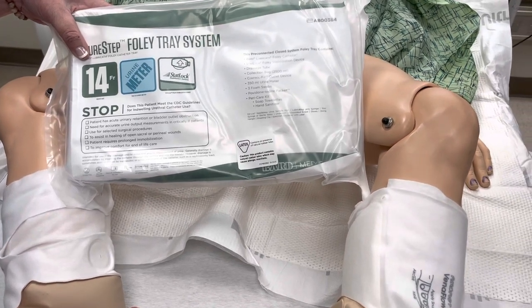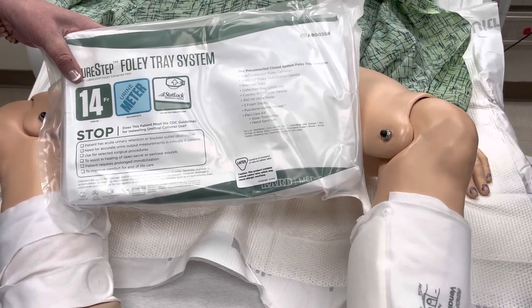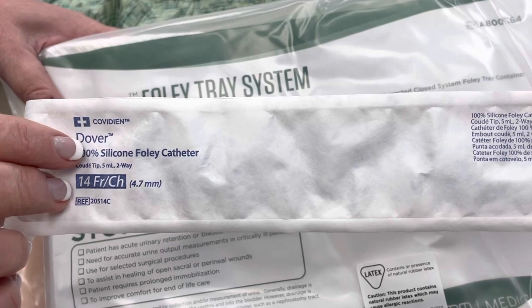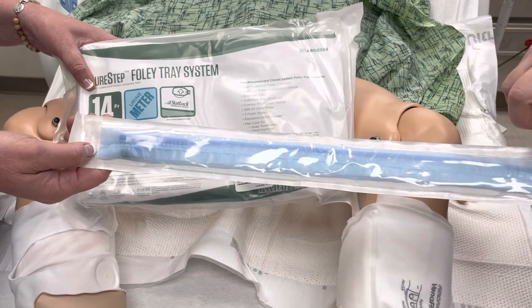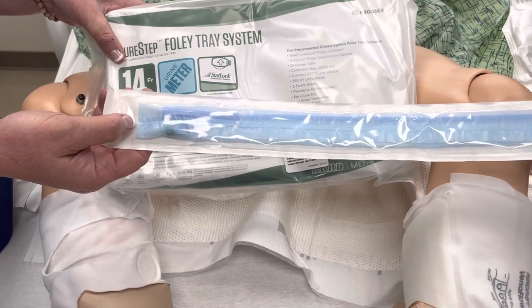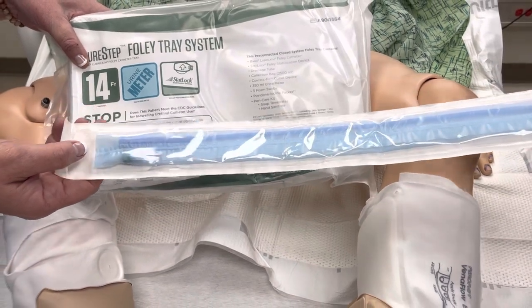Coude tip catheters look a lot like the catheter that's packaged in the system; however, the tip is curved to be able to go around the prostate more easily and to be more comfortable for your patient. Those are stocked in your clean supply room along with your catheter kit, so you would need to grab that in addition to your kit — it is not part of what's packaged in there. It is packaged in two layers: the first outer white layer is not sterile, however the blue packaging is sterile, and you will need to add this to your kit in a sterile fashion once you get your sterile area set up.